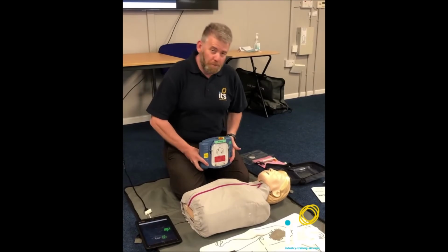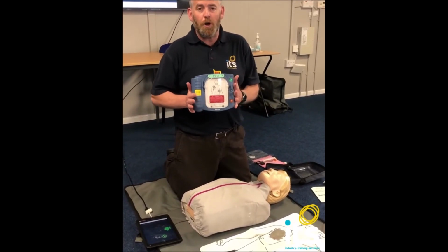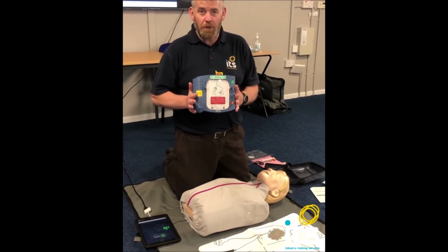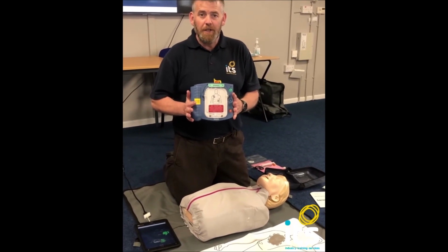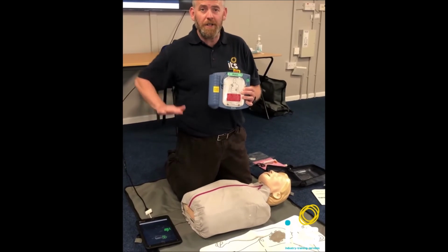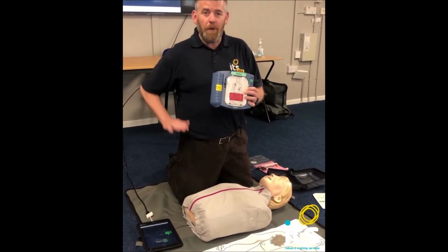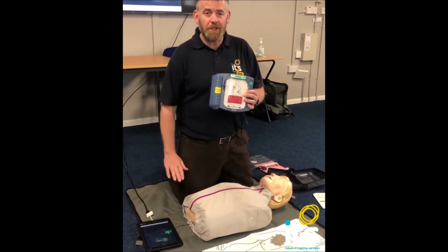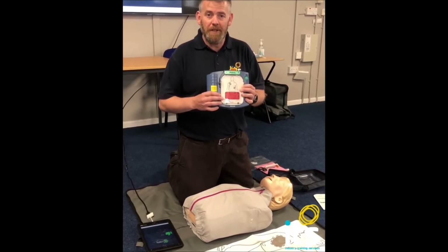Hi folks, so just moving on then from manual CPR, we're now going to introduce the use of a defibrillator. Defibrillators are electrical devices, so they're monitoring the electrical activity of the heart. So CPR has to be started first, because if there's no blood moving through the heart, the electrics won't work. However, when defibrillators turn up on the scene, it doesn't matter what phase or what stage you're at in CPR, you stop immediately and attach the machine to them.